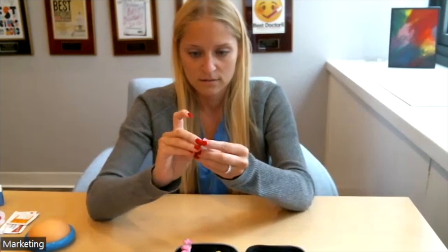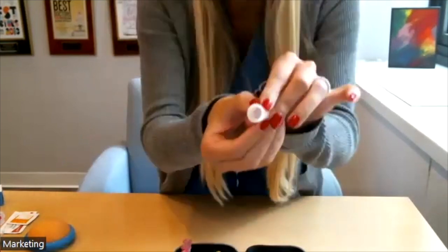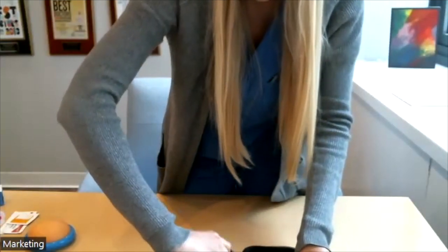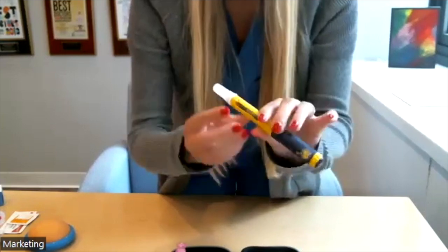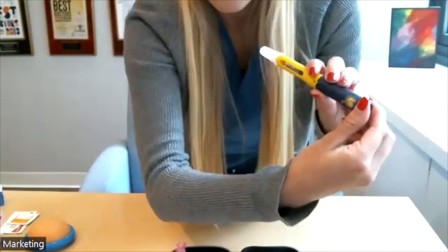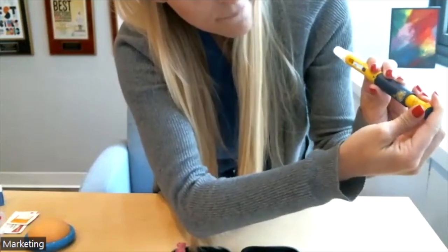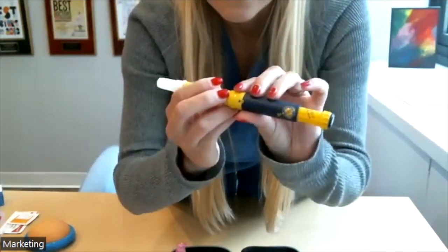Each pen comes with separate needles that you'll put on. Take the cap off — you'll see a little pointy thing at the end. Put this onto the end and screw it on tight. Then dial up to your specific dosage. If your dosage is 300, dial the window until it reads 300.